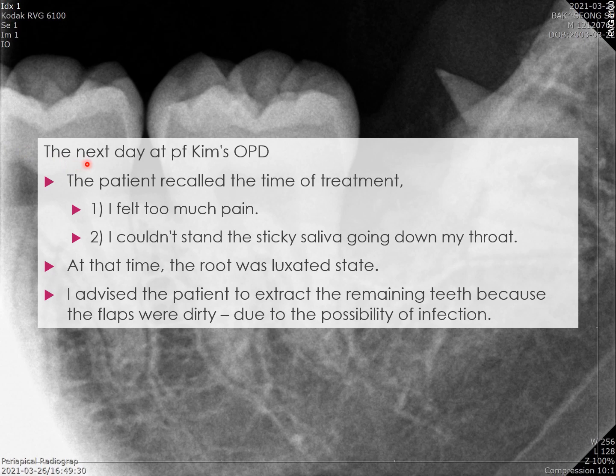The next day, the patient came to my outpatient clinic. The patient recalled the time of treatment. I felt too much pain. I couldn't stand the sticky saliva going down my throat. At that time, the root was in a luxated state. I advised the patient to extract the remains because the flap was dirty, due to the possibility of infection.